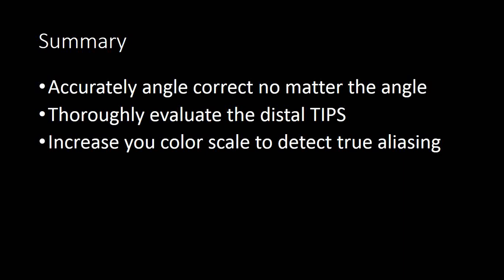Thoroughly look at the distal TIPS. It's hard to see. This is the hardest study that we routinely do in our ultrasound department. There's no question about it. The patients are hard to deal with in terms of positioning. Their livers can be echogenic and coarse. It's a very, very challenging study.